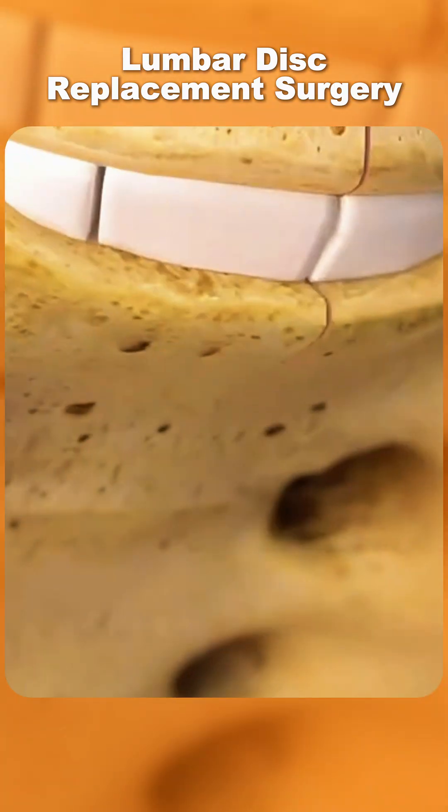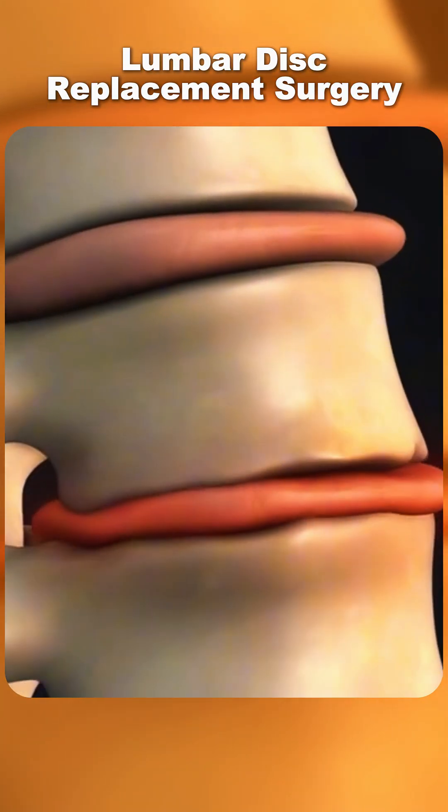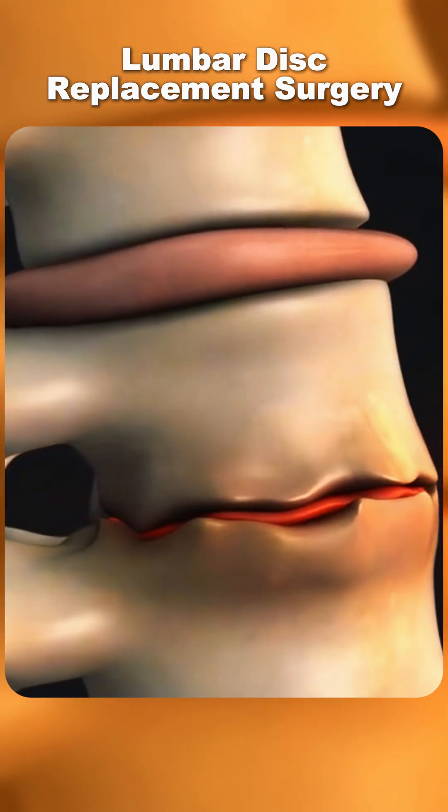Ever wondered how lumbar disc replacement surgery is performed? This procedure is designed to treat severe back pain caused by a damaged spinal disc in the lower back.